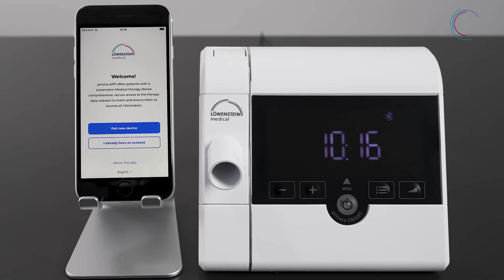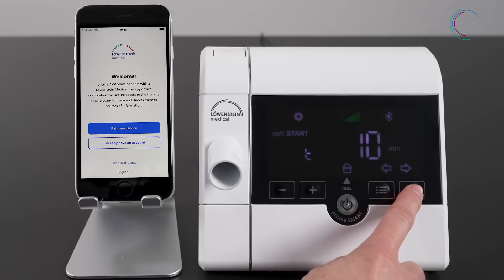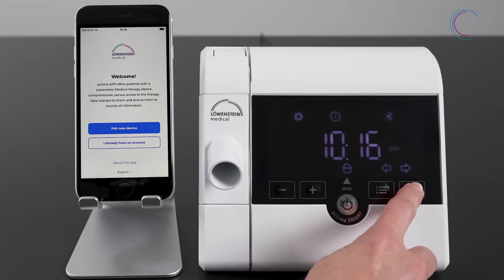To enter the menu, press the menu button on your therapy device. Then go to settings. Press the arrow to the right until you reach the blue setting.